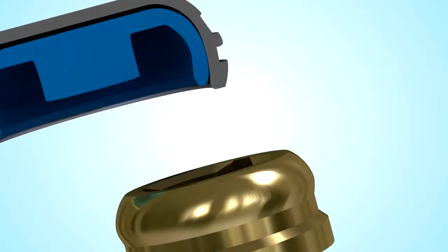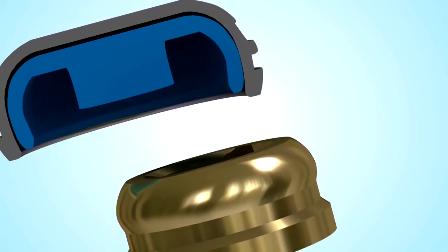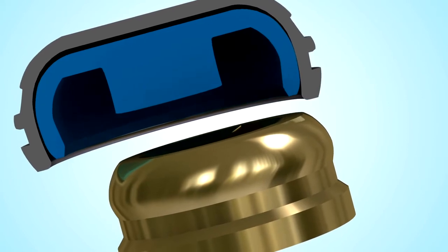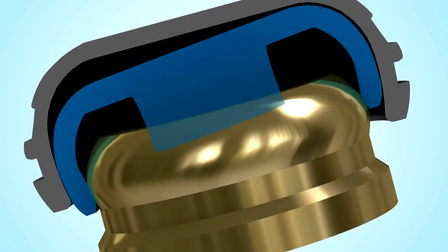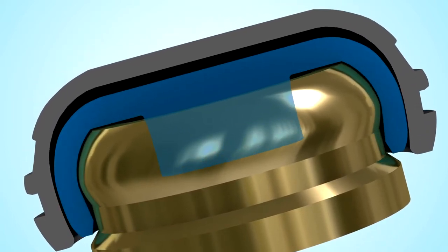Look closely at how the Locator's pivoting action and self-aligning design allows the attachments to seat effortlessly. The rounded surface of the Locator attachment allows the male to center on the attachment before engagement, so it can easily locate its proper position, while the Locator male pivots inside the denture cap. These two actions in concert allow the Locator to easily self-align into place.